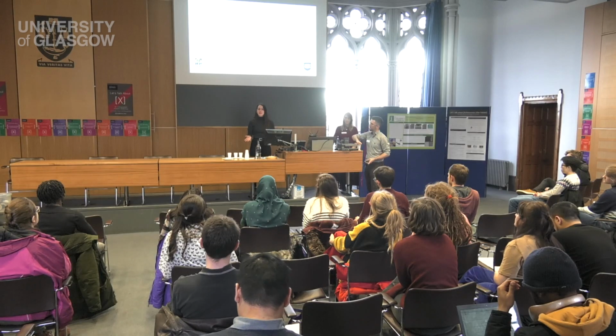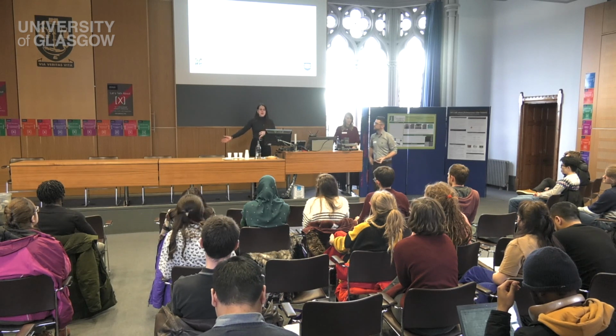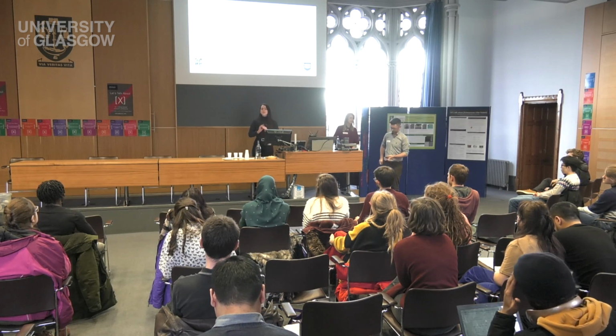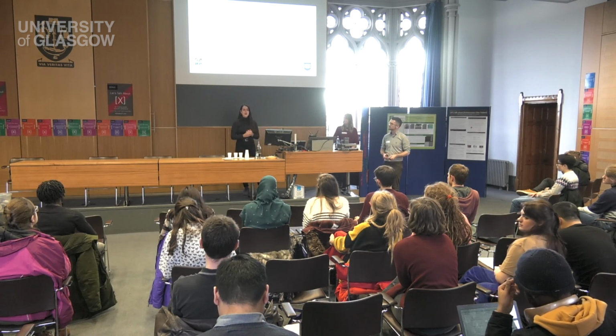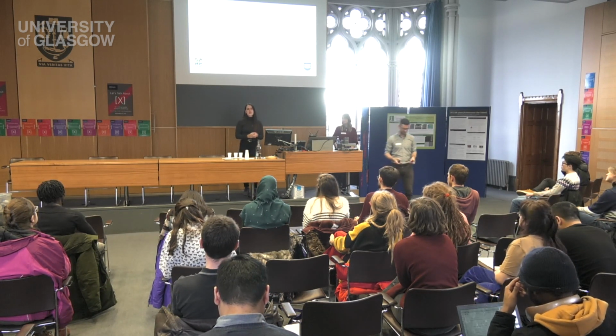So for things like the legs, arms, we're not worried about breath hold scan time there because you don't have to hold your breath with it, it's not moving. So it works really well in static imaging, and that's one of the hopes, that with the fact that we've implemented this with reduced scan time, it could be used in things like the digestive tract, because your esophagus kind of moves over time, there could be implications for its use in that. Hopefully, that's where it'll head.